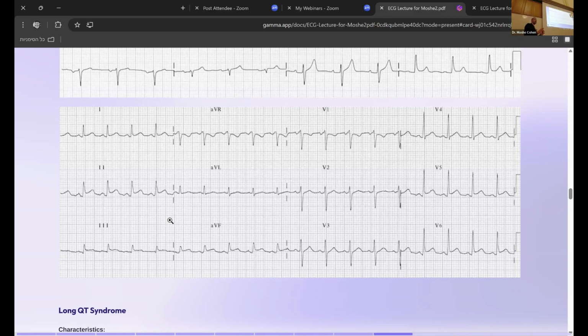So myocarditis, some patients skip out of it with nothing. Some patients die from it. This is a medical emergency. Myocarditis can develop from pericarditis and it can become very dangerous. So remember, with ECG, we are diagnosing not only ischemia and arrhythmia, we can also diagnose inflammation. Inflammation of the pericardium, inflammation of the heart.